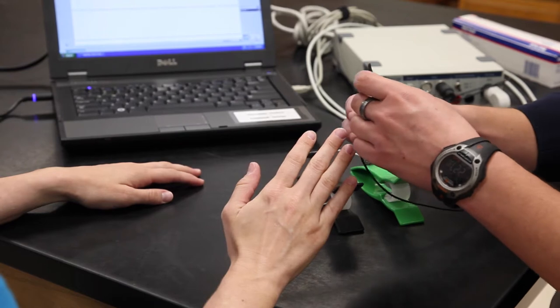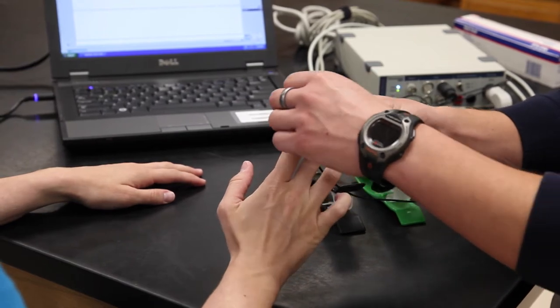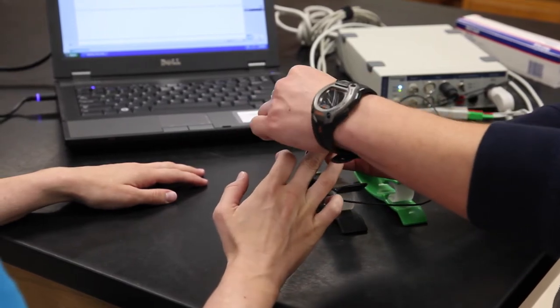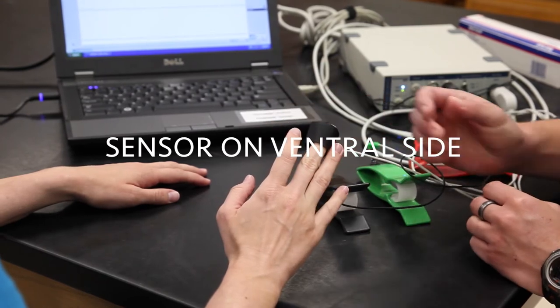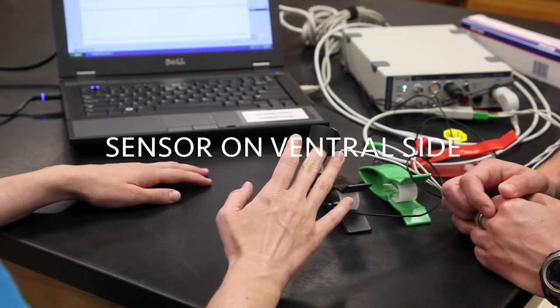Connect the pulse transducer to the tip of the middle finger on either the right or left hand. Wrap the velcro tight enough so the subject feels a pulse, but not tight enough to compromise circulation.